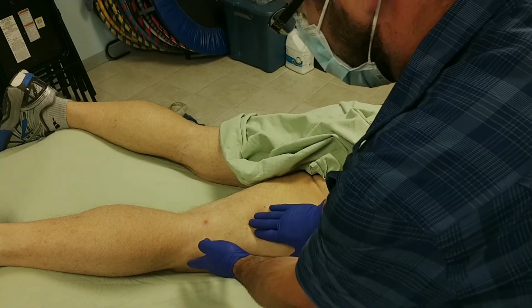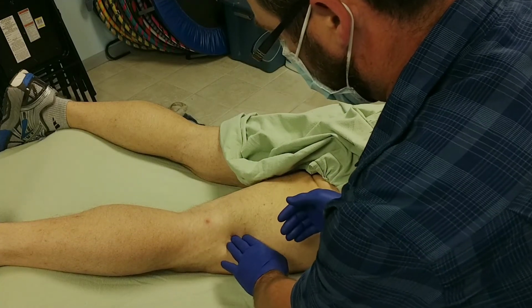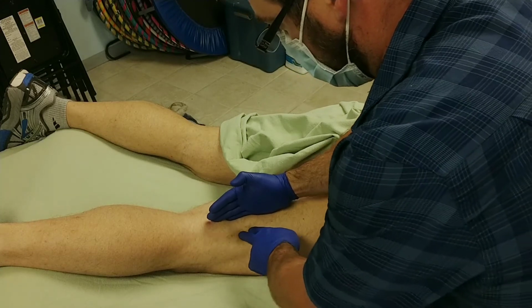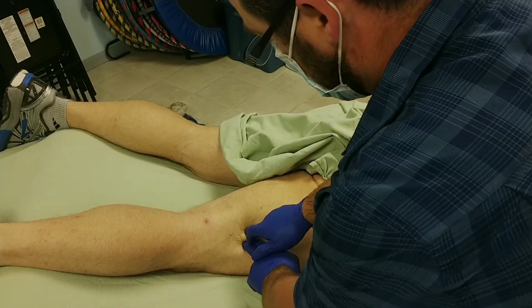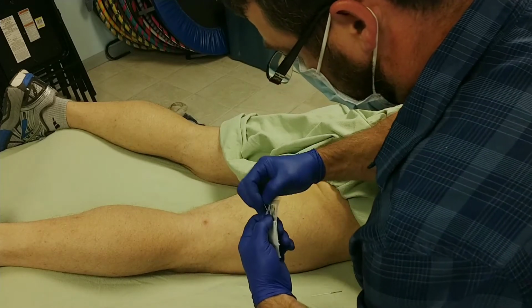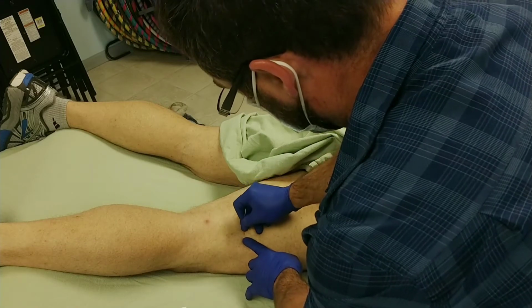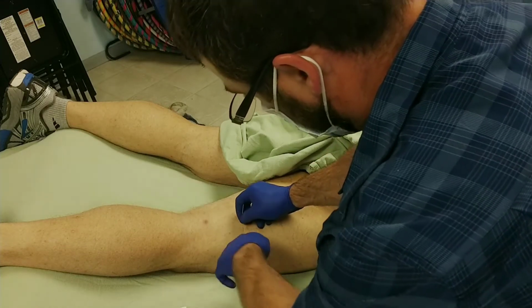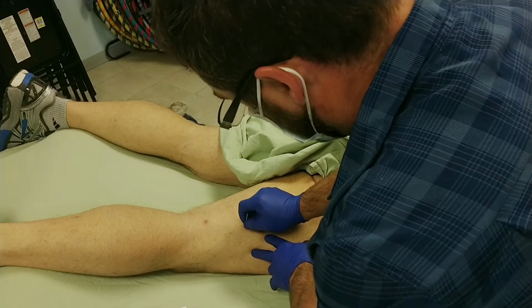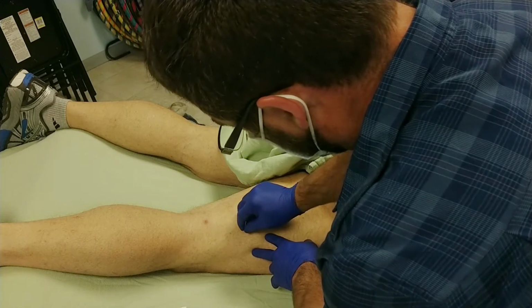If you're worried about the biceps femoris short head, you're going to be in the distal third or so of the posterior aspect of the femur. Again, we don't want to be straight on the midline, we're just off to the side. We're going to be pressing in kind of deep. Grab another needle here. Again, angling slightly away from the midline in this position. And this one is a little deeper, so you're going to need to needle a little deeper.